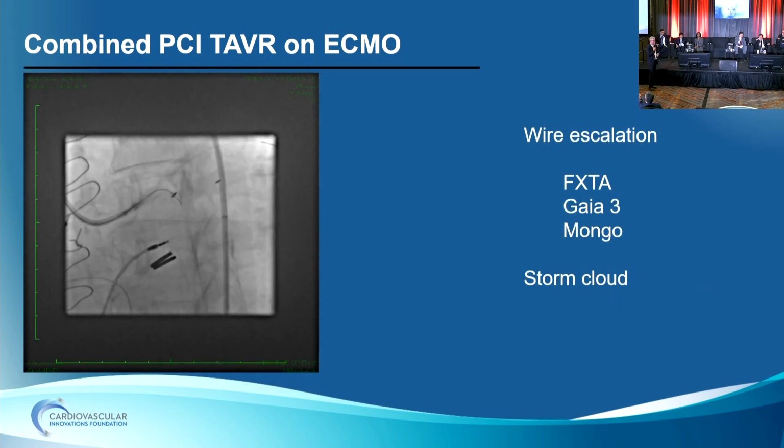But that can be helpful sometimes in post-TAVR PCI also. So we got in there, we got a safety wire in the LAD, we got Corsair, tried to get into the circ with just a simple workhorse wire, thinking this must be fresh, and it wouldn't go. So we started to escalate a bit as if this were a CTO. We got the Fielder XT, it wouldn't go.